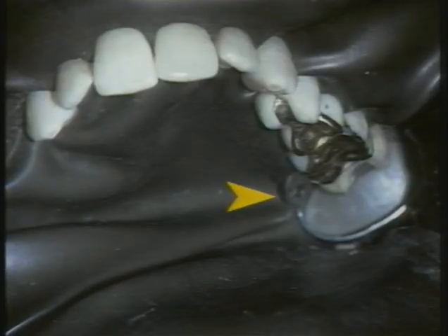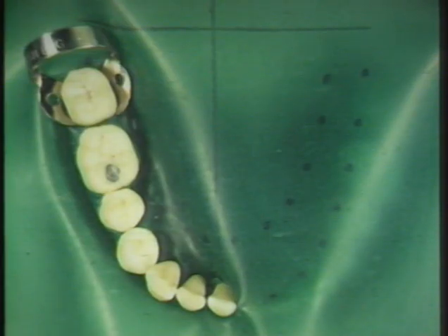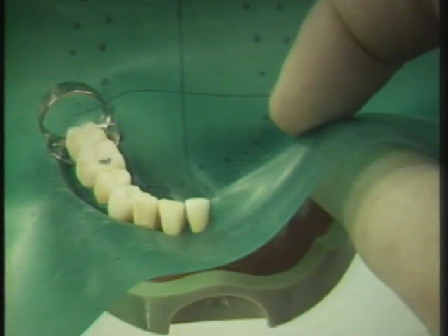The two most important methods of anchoring a rubber dam are with a rubber dam clamp and with a suitable contact point. A rubber dam clamp is usually necessary for holding the rubber dam to a molar, while at the front of the mouth it is usually appropriate to use the contact point between two teeth to pinch the rubber, forming the edge of the terminal hole in the rubber. Let us consider operating on a first molar.